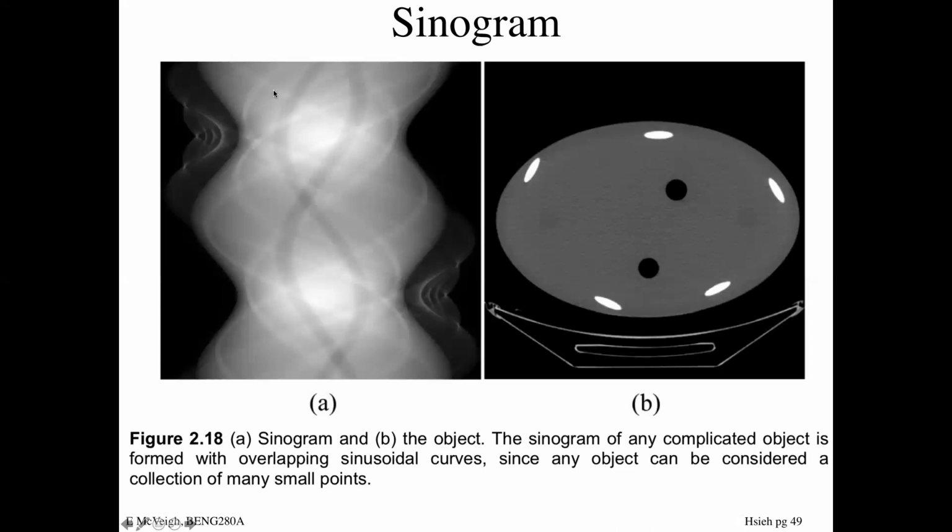You can see certain features in the sinogram. So as theta changes, say this dark feature here oscillates through the sinogram, and each one of these dark features are these circles here. And here's a bright feature, which is an ellipse, and you can see the ellipses also go through the object, and they change their width depending on what angle you're looking at them. If we're looking head on this way, they'll be thin. If we're looking down this way, they'll be a bit thicker.